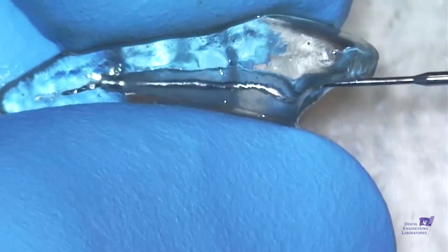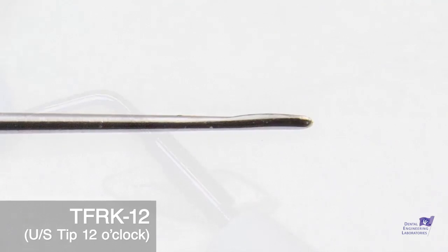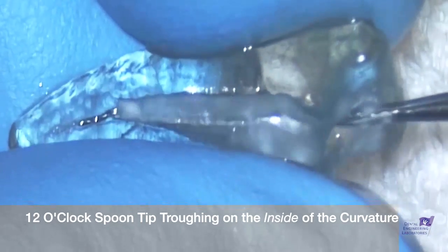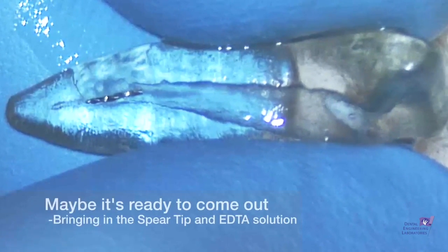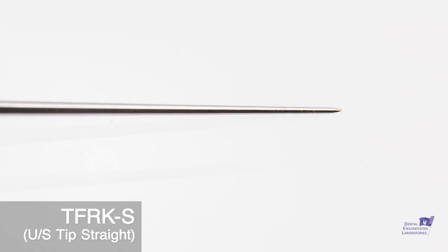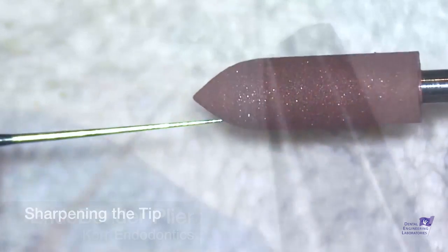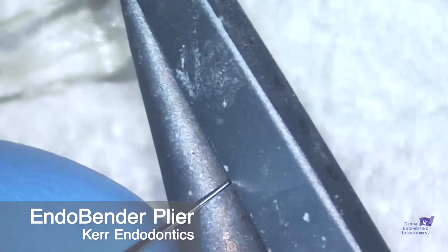The spoon tips are really cool — they go around the file to deepen the troughing effect. The number six has a spoon shape facing towards us; we're using the number 12, which faces away from the handpiece handle. You can see with that 12 in there a really nice trough. Maybe it's time to take it out with the spear tip. These come in a very tiny size, but I like to sharpen them. I also use a Brownie point to sharpen the spoons, and then I use an endo bender plier to bend the spoon or spear tip so it's going to go to the inside of the curve.